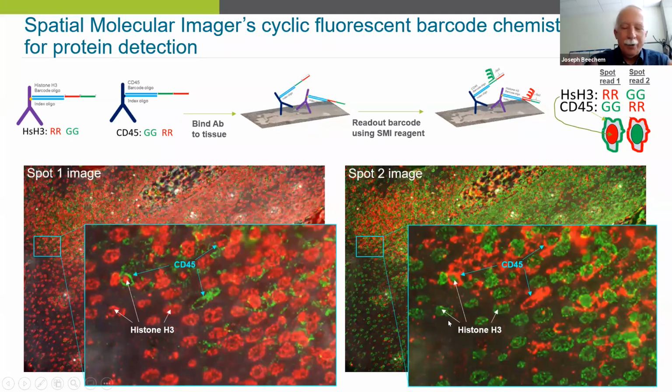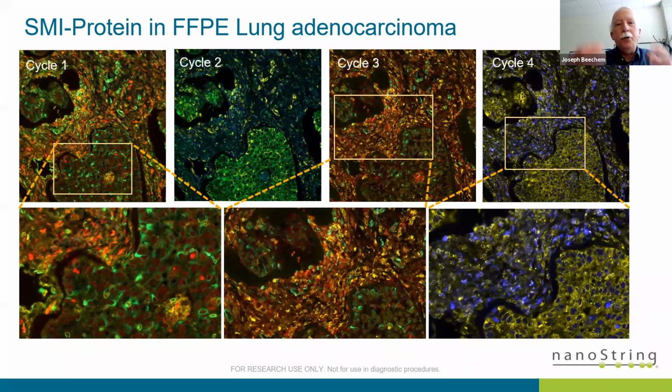That gives you an idea how it works, and that you can see with your eyes that it's doing the right behavior. And when you get into real tissue with real plexes, of course, you can't just look at it with your eyes. You actually have to encode the information and decode. This gives you an idea how tissues look.